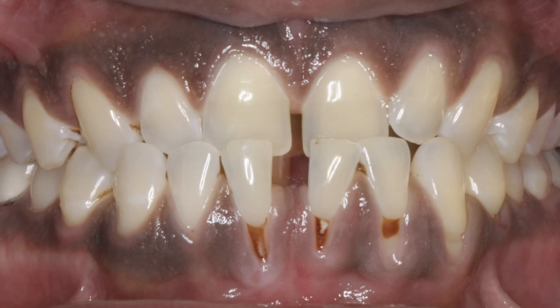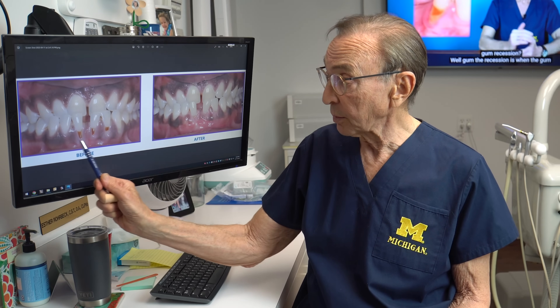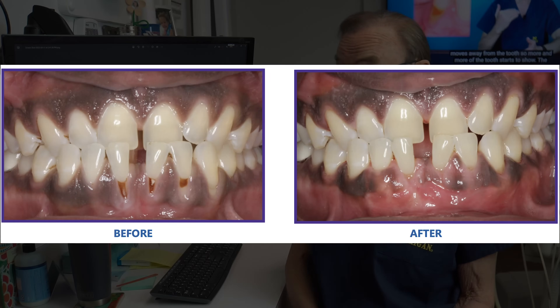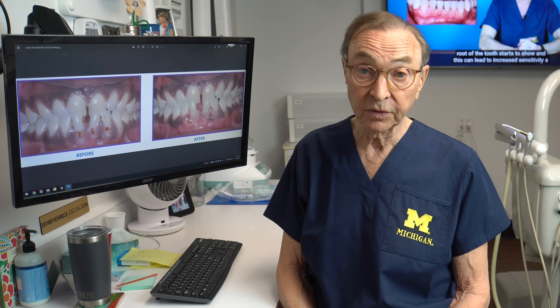Another interesting case — these teeth were actually starting to get decayed. You can see those stained areas here. So we polished — the decay was not too deep — we were able to just polish that decay away basically and bring the gum tissue up to cover it, so that would eliminate that problem and again prolong the life and hopefully save those teeth for the rest of the patient's life.